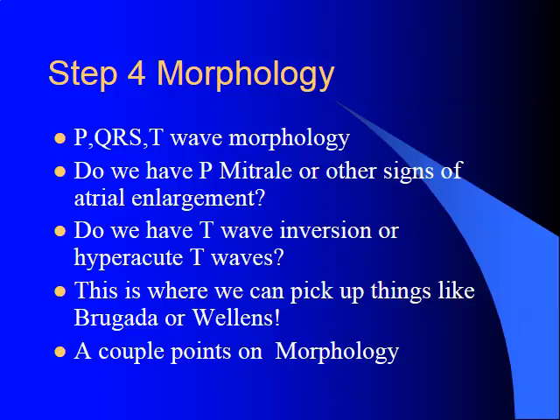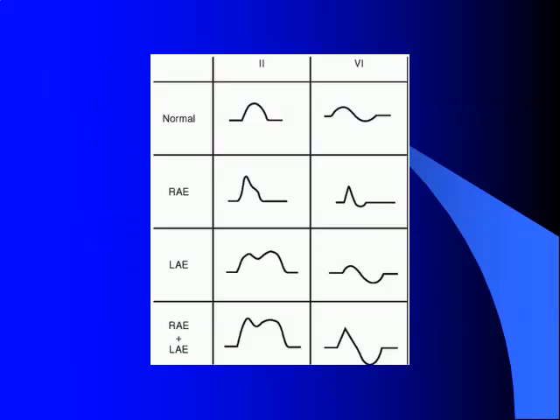A couple points on the QRS morphology. Real quick, I just popped this picture in here. I think it's a good aid. I'm not going to really touch too much on P waves. I just want to put this out here so you guys have it available. These are some examples of P waves that you can see, variations.